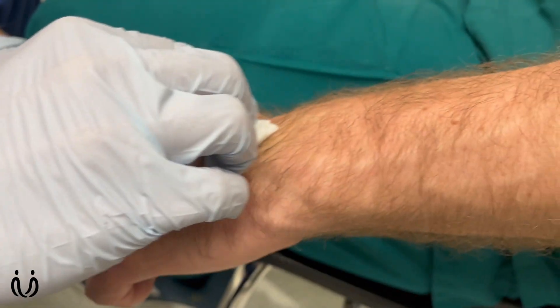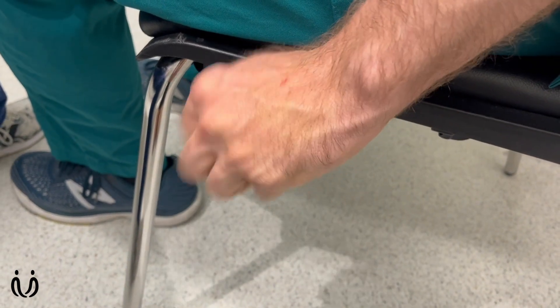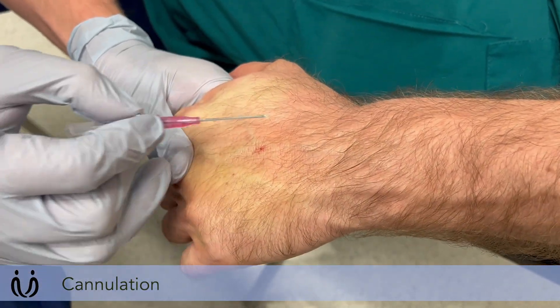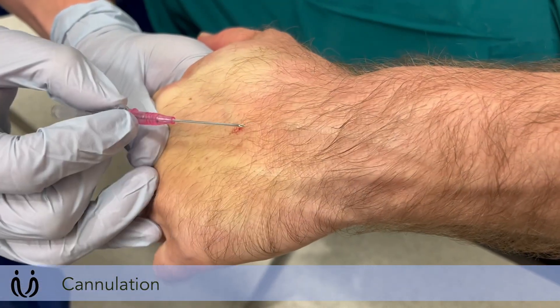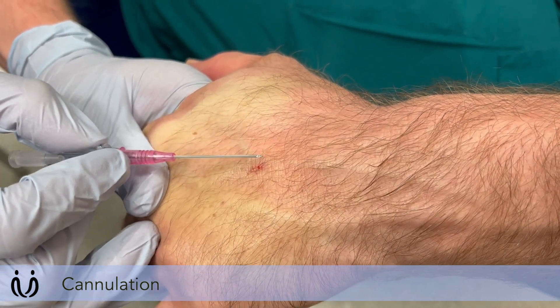Swab that area again to make sure it's nice and clean. Clench your fist a few times. I'll stabilize the skin just like that — stabilizing the vein as well — and just flex the wrist a little bit. I'm going to place the cannula in where the local anaesthetic is, in the area I've swabbed.